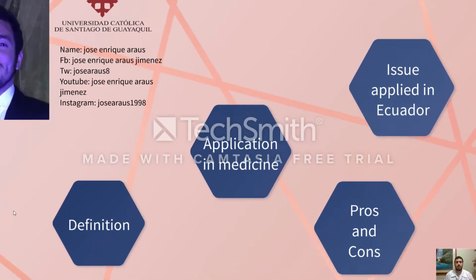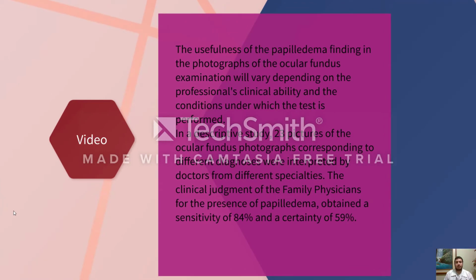Application in medicine. The usefulness of finding papilledema in the photograph of the ocular fundus will vary depending on the professional's clinical ability and the conditions under which the test is performed.